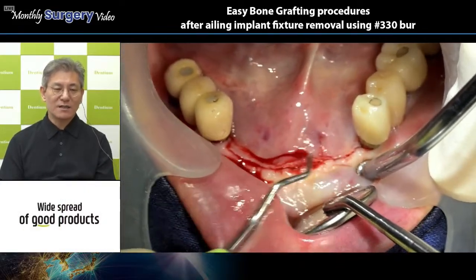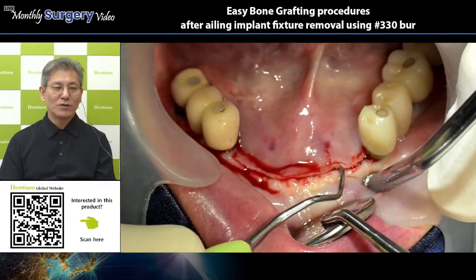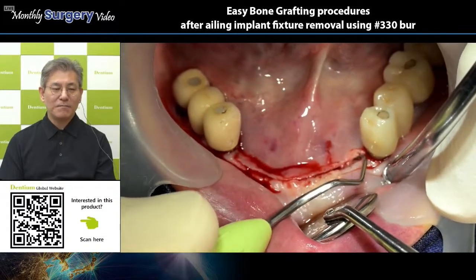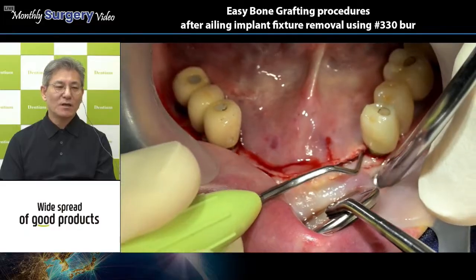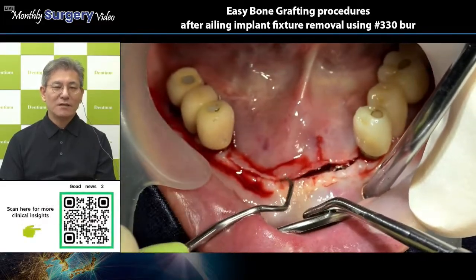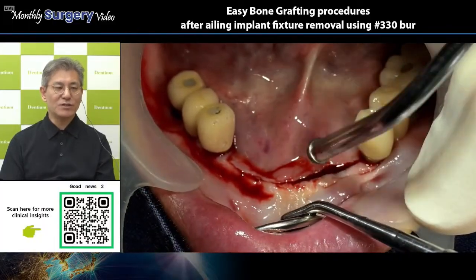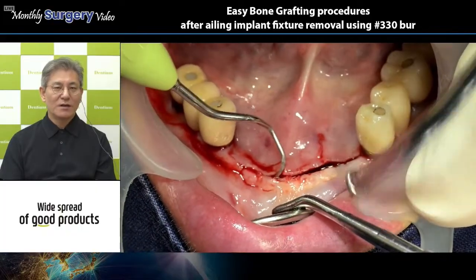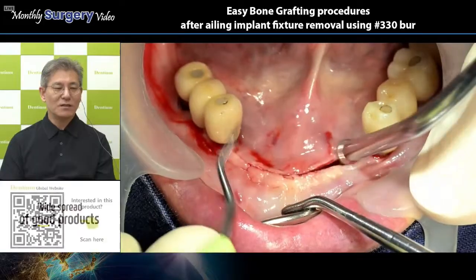This paracrestal incision is more useful to manage the reflected flap, to make the osteotomy, and sometimes to make the handle for the crestal approach for sinus elevation. All of these situations are possible when you have the paracrestal incision on the maxilla.